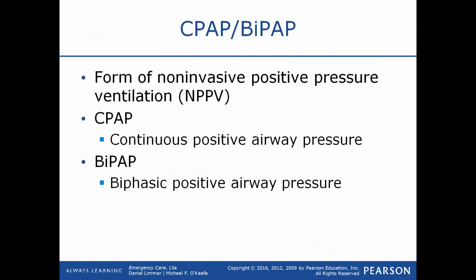CPAP is continuous positive airway pressure, and unlike bag mask ventilation that we would provide with a BVM, with CPAP we can provide continuous pressure, both inhalation and exhalation. Bag valve mask ventilation just provides pressure on inhalation. It doesn't provide any pressure on exhalation.